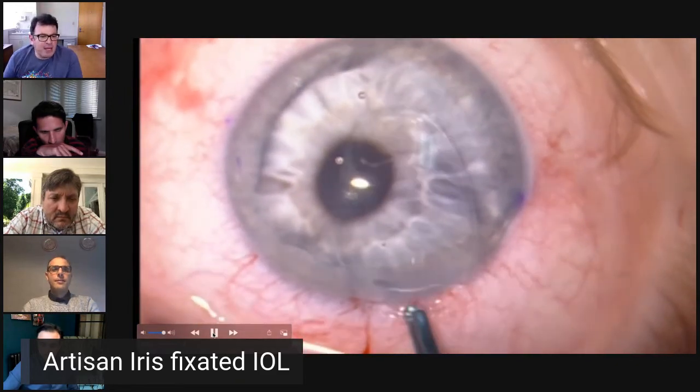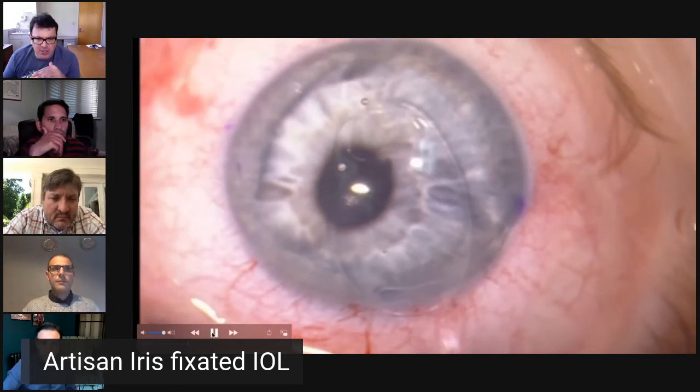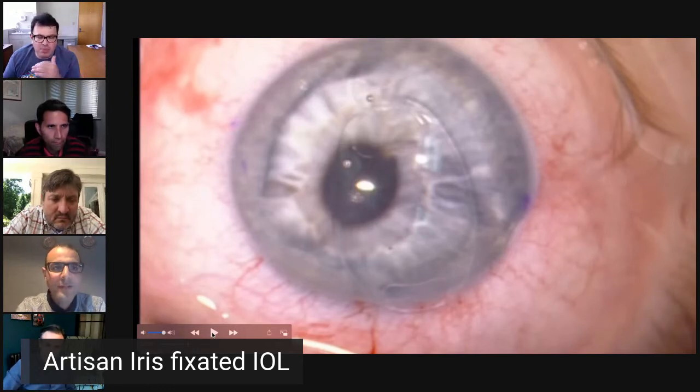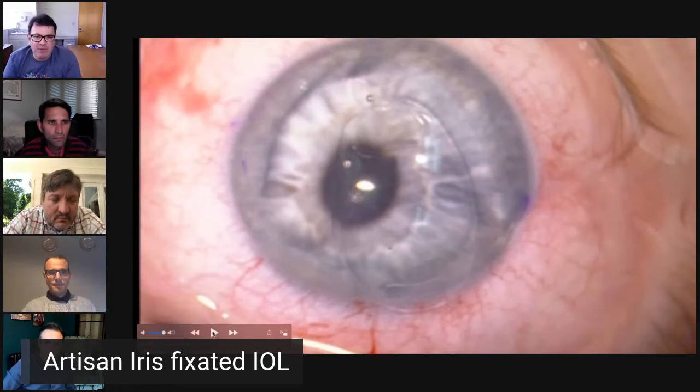So, Abdallah, can you tell us more about the angle? So you want the lens to be, wherever you put it, away from the iris, right? Yes, because the lens has a little bit of slight angulation, so the vault is away from the iris. Whether you put it anteriorly, so it's vaulting away, or you put it posteriorly, so it's vaulting away from the iris. Yeah, exactly. So you vault away from the iris.